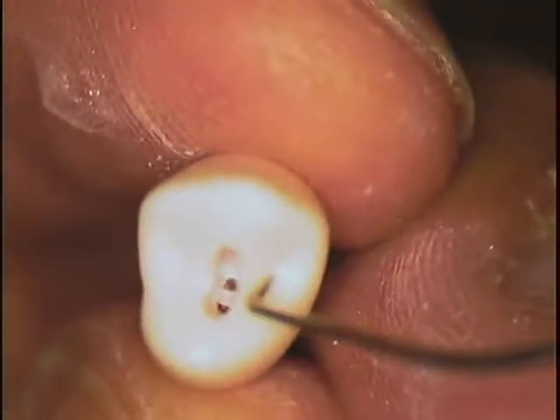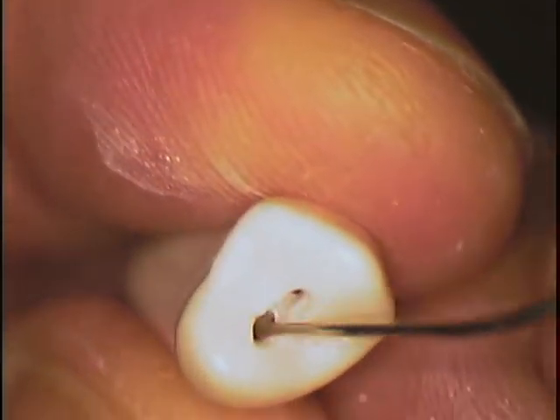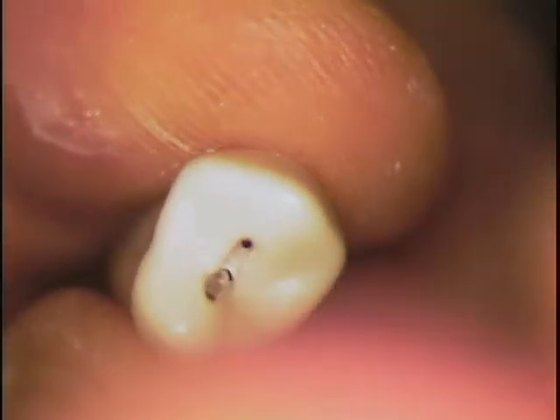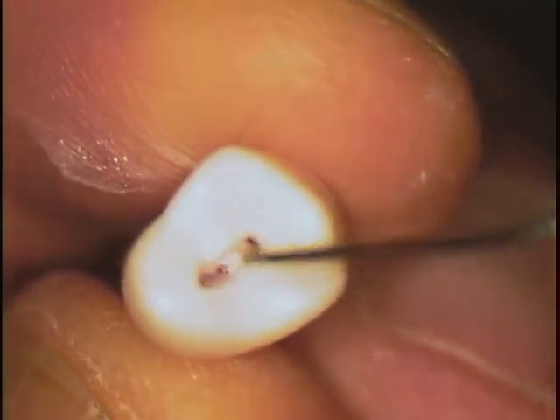I just want to demonstrate that. Let's try this one. I think that should do it. Yes, this is it. Okay. So if you send this in there and actually turn it a little bit, you'll get underneath and you'll lock underneath the roof. See how I demonstrated that? So now you know that that has to be cleaned out.